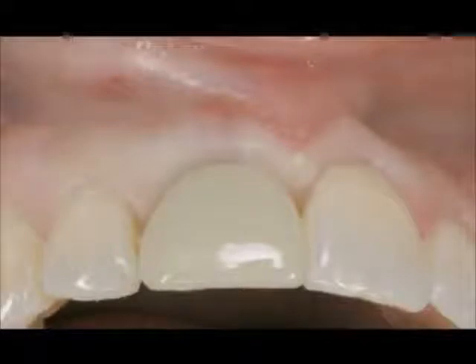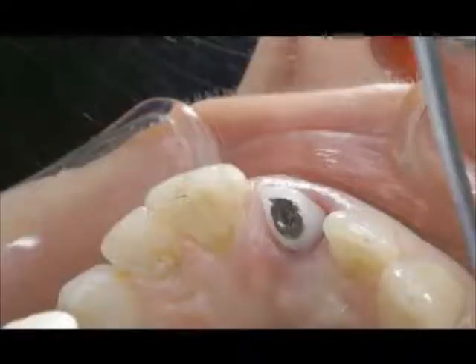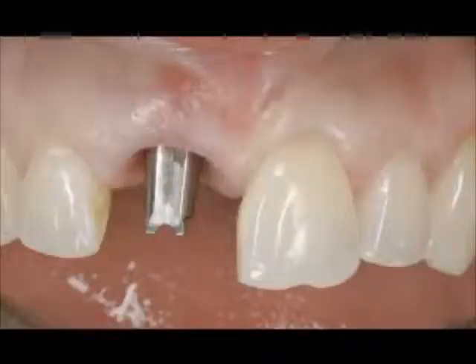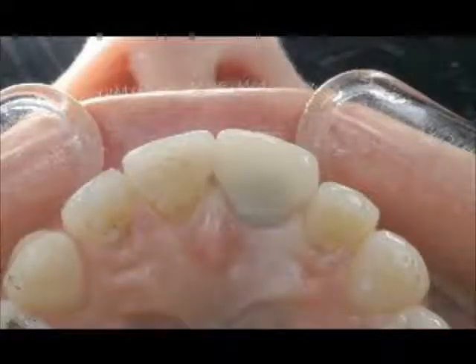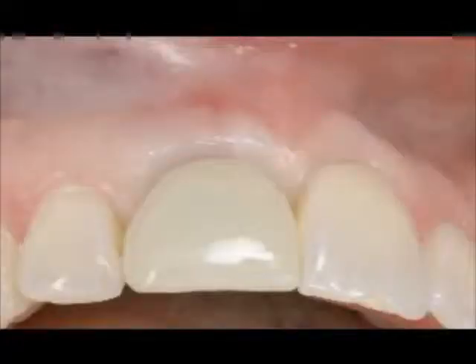And you can see now at approximately the day of surgery, we utilize the temp base reduction coping to reduce the abutment in the mouth. This is what it looks like after reduction. And this is what it looks like right before cementation. Now, because we have a snap-on component, we don't have to cement this with traditional cement. I use Arestin antibiotic paste, so there's no cement introduced subgingivally to cause inflammation.